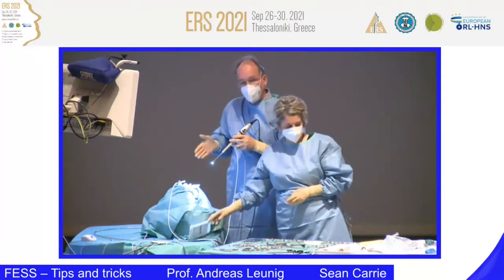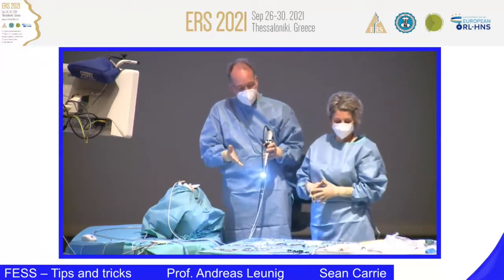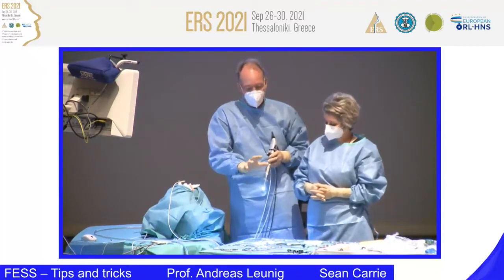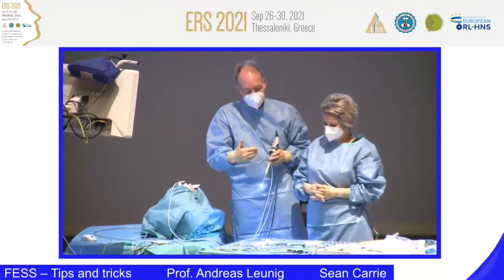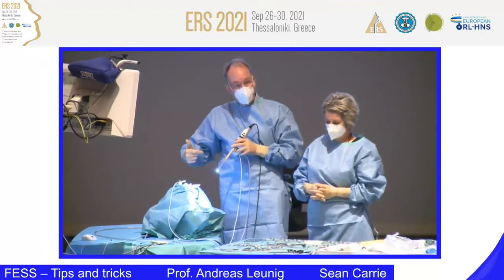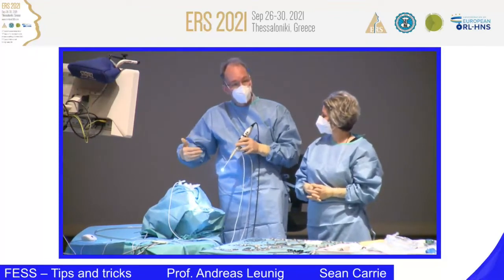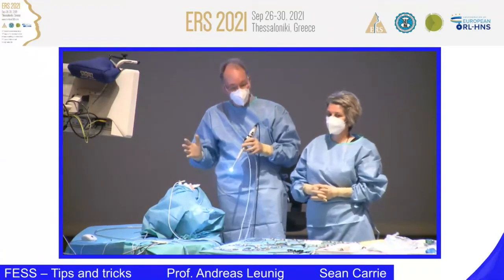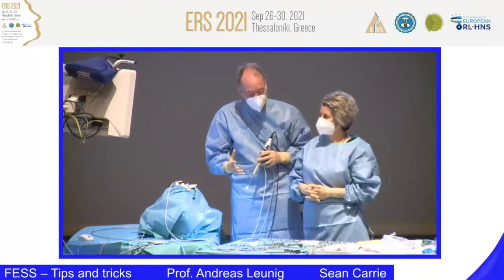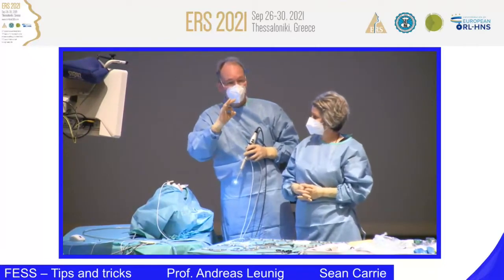So now coming to the instrumentation, the classical one. This is a luxury collection, of course, but I think you have to have special instruments to perform this kind of surgery. We are talking about Messerklinger and Stammberger's technique, the school of Graz. I don't show you anything different. The instruments are very, very helpful for this, otherwise you cannot do it. The straightforward instruments use a 0-degree endoscope.